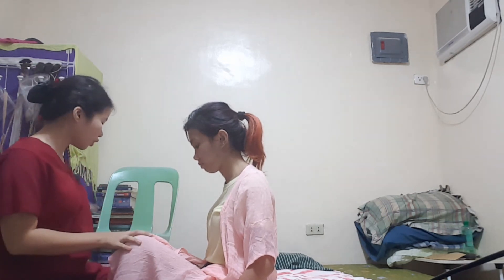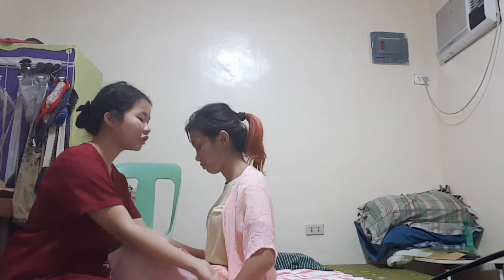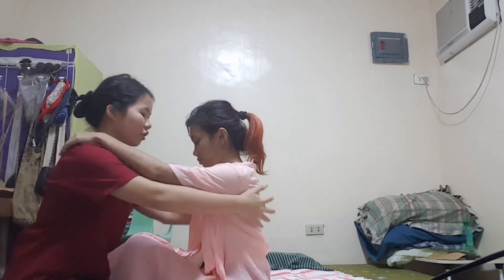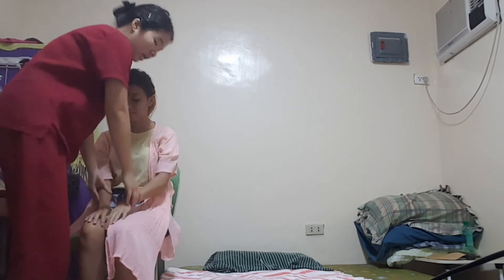Now the next variation: transferring a client with an injured lower extremity. When the client has an injured lower extremity, movement should always occur toward the client's unaffected strong side. For example, if the client's right leg is injured and the client is sitting on the edge of the bed preparing to transfer to a wheelchair, position the wheelchair on the client's left side. This makes it easier to move the patient and minimizes the risk of injury for both the patient and the nurse. We're going to move the wheelchair to the patient's right side since her injury is on her left side. I need you to put your hands on my shoulder — we're going to move on the count of three: one, two, three — okay. And now we're going to let the patient sit. One, two, three — okay.